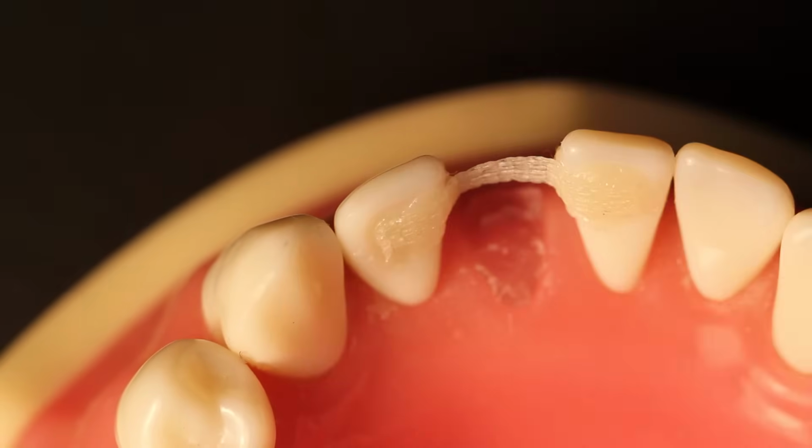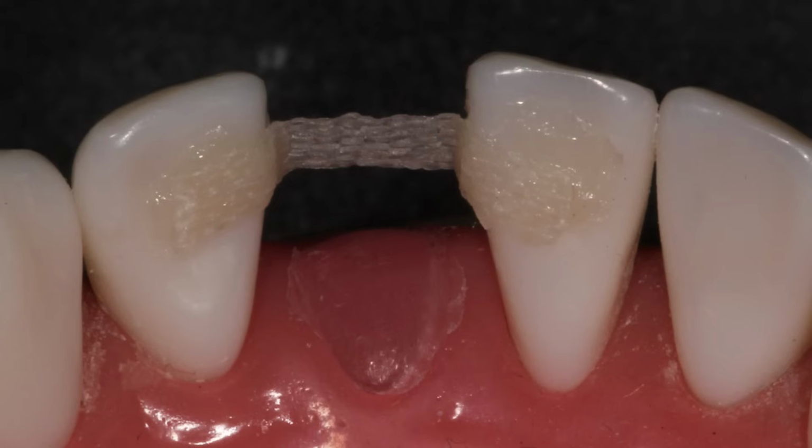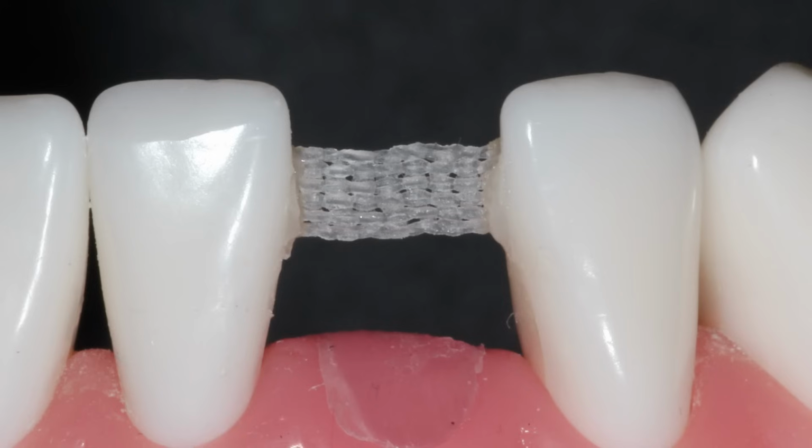Try to make the ribbon cross the pontic space in a straight line and orient the ribbon so that it is placed under the incisal edge of the pontic. This way, the forces from the pontic will be directed onto the ribbon framework.